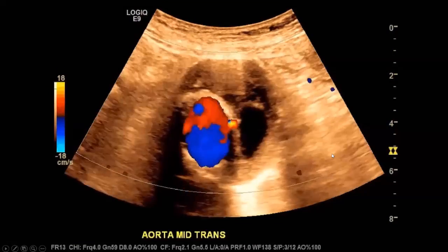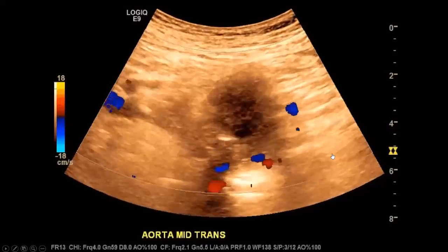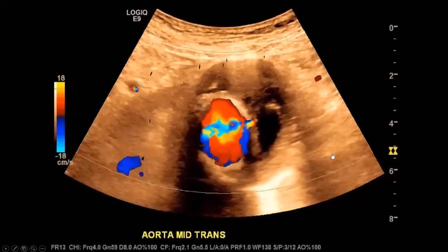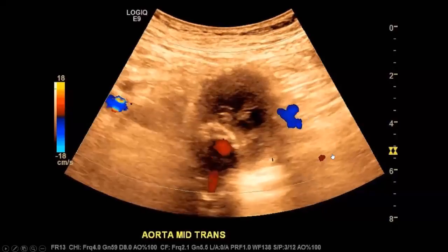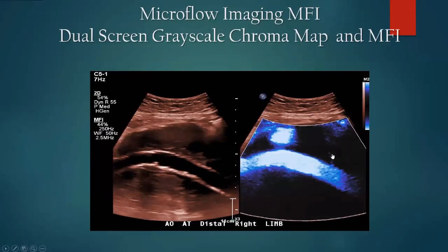And then, do your cine loop sweep. Nice and slow. Set your sweep speed to about 10 to 15 seconds, and just do some slow sweeps, not only with your color Doppler, but use your power Doppler as well. And don't forget to take still images too. So one of our other vendors has this microflow imaging, the MFI, and this is also very helpful. It picks up low blood flow as well.